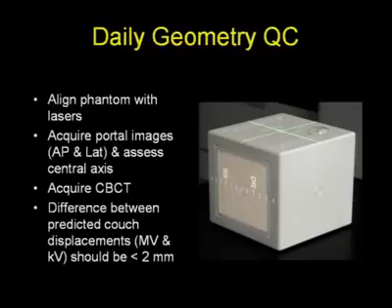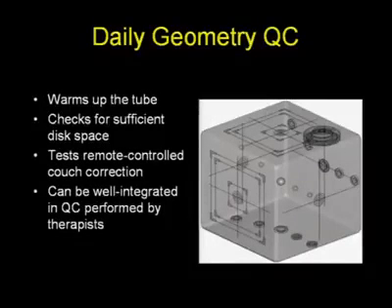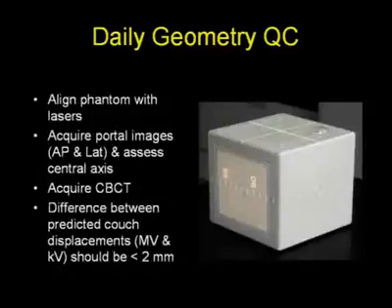This is a picture of the Phantom, and this is a CAD drawing showing the inside. So we have a reference sphere at the center of the Phantom, and some others with rings in order to provide some orientation information. But again, in a pinch, a ball bearing stuck on top of a styrofoam cup will do just as well, and will allow you to make sure that the position of the ball bearing, or the central sphere in case of this Phantom, can be known and registered with respect to the radiation isocenter.